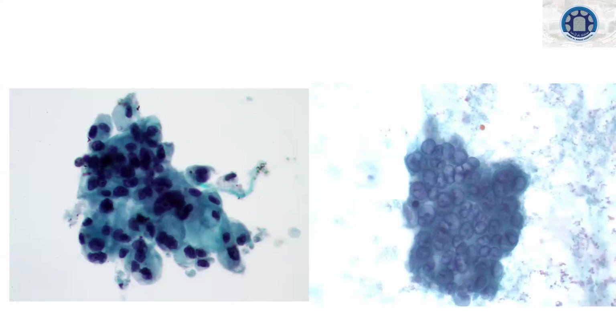One answer is mucinous cyst adenocarcinoma. It is pancreatic ductal adenocarcinoma. Okay. Mucinous cyst carcinoma will have a cyst. Now I'm telling you it's a solid mass in the pancreas. Solid mass is usually pancreatic ductal adenocarcinoma. If it is a mucinous neoplasm, there is usually an associated cyst with it.